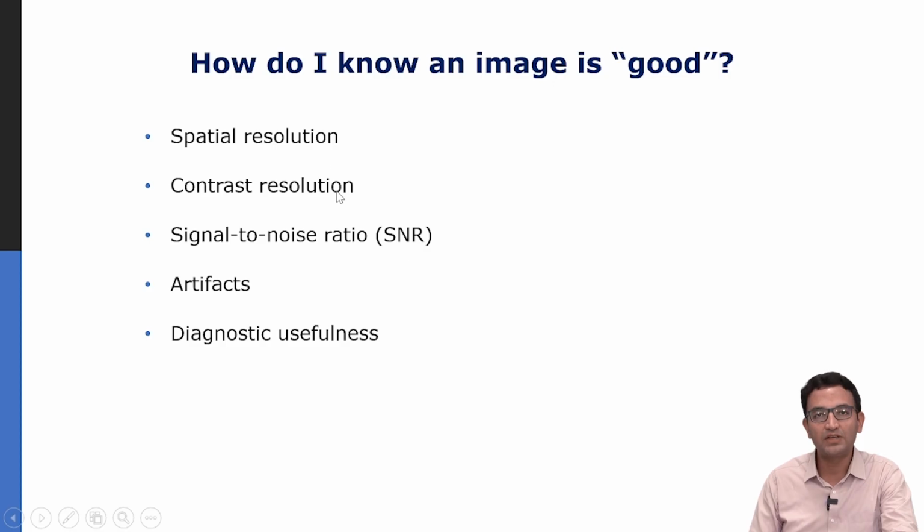Then comes the contrast resolution or the contrast. I think you are familiar with the fact that if you wear a white dress and let's say stand next to a white wall, when you take a picture, you will not get very good contrast in the image. Now, there might be enough light, there might be enough signal, however, there will be poor contrast, which will reduce the ability to visualize you against the wall. And that is why contrast is also an important parameter when we assess the quality of an image.